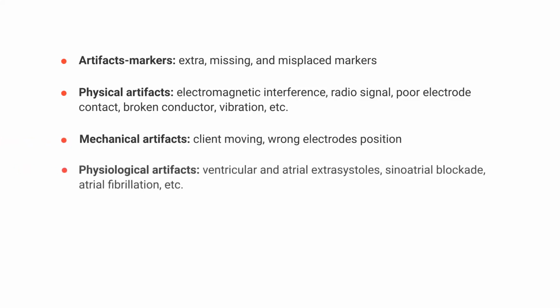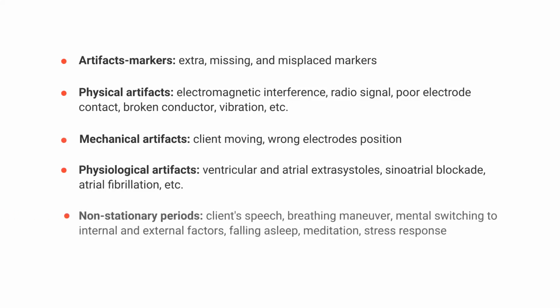Physiological artifacts are caused by biological processes in the body: physiology of the heart, ventricular and atrial extrasystoles, sinoatrial blockade, atrial fibrillation. Also, non-stationary periods due to physiological processes such as the client's speech, breathing maneuver, mental switching to internal and external factors, falling asleep, meditation, stress response. Let's take a closer look at each of the artifacts.